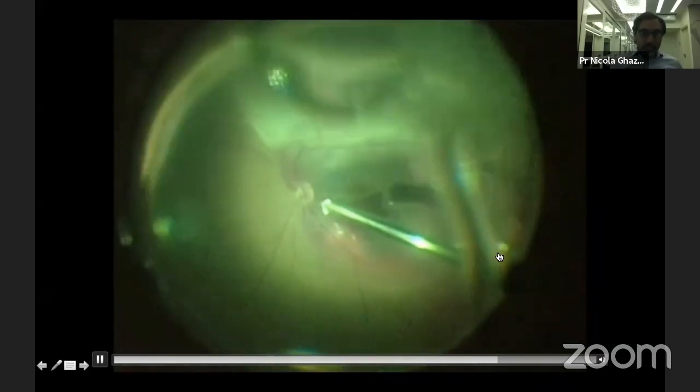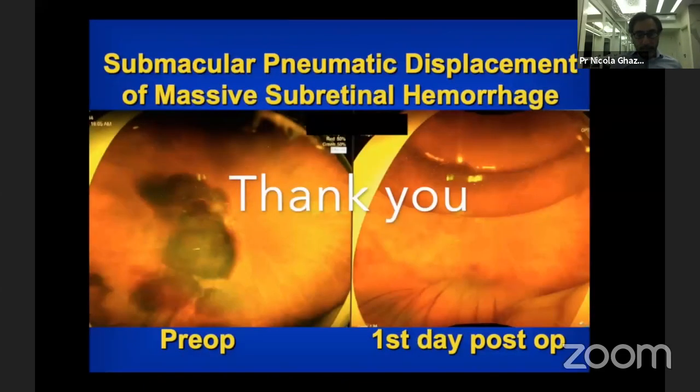by these maneuvers. Now you can see here that the subretinal air can reach the ora sometimes, and hence the value of air fluid exchange. I do exchange about 50% of the vitreous cavity with air, and then I replace that with a long-acting gas, typically SF6, in such cases. You want to fill only 50% of the cavity because you want to trap the air bubble in the macular area where it should act. And this is the end of the case.